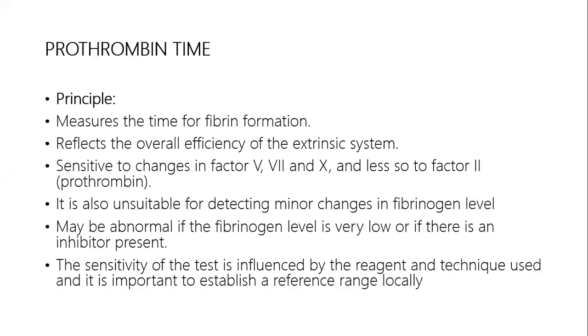All right, so let's start with the screening test. Number one on the list would be the prothrombin time, or what we usually call PT, right? Prothrombin time or PT. So the principle of prothrombin time is as follows. Prothrombin time measures the time for fibrin formation.